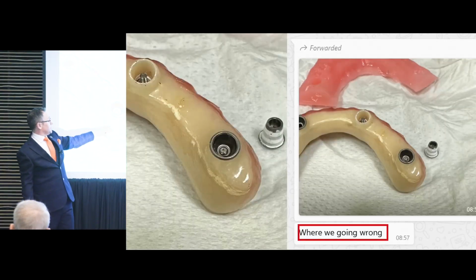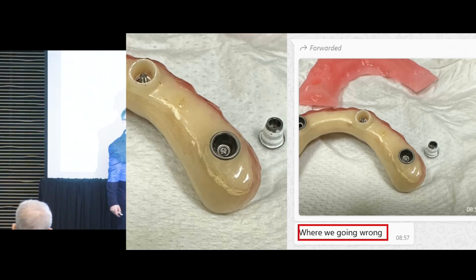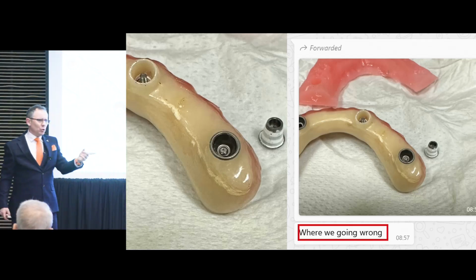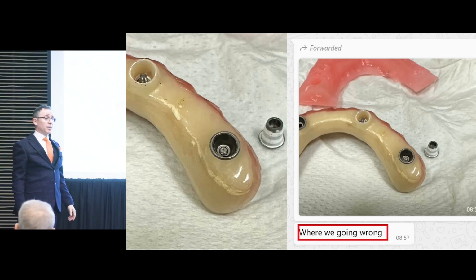A friend of mine sent this to me and said, where are we going wrong? And I was like, well, that's a printed resin. Did you do that on the model? They were like, yeah, of course we did. We always do it on the model. I was like, that's where you're going wrong.